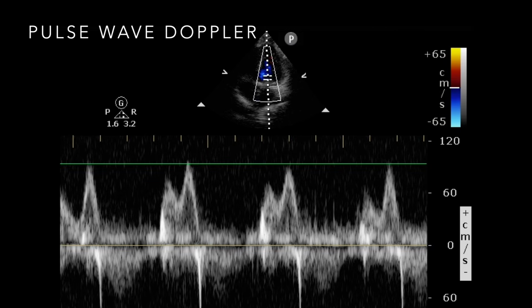And so it gives you some velocity limits as you're interrogating this particular area of the vascular flows. That limit is about 1.5 meters per second. So here's a little arrow that shows you where that gate is, if you haven't found that already.